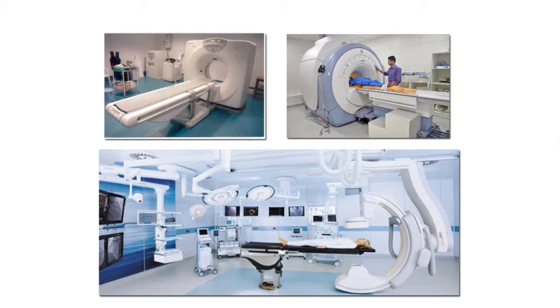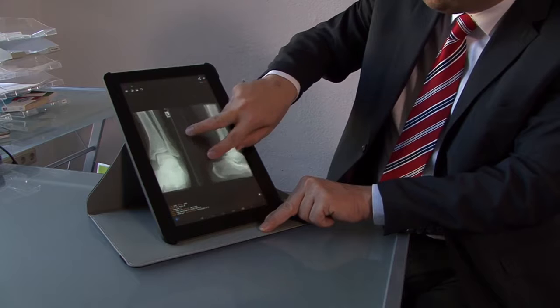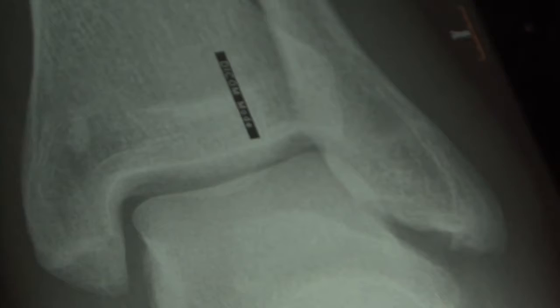Healthcare is one of the most conservative cultures when it comes to adopting new technologies, and in many respects, medical professions lag some distance behind the outside world, especially when it comes to mobile devices. Dr. Arpad Bischoff, a radiologist, noticed the absence of smart technology in his specialty and wondered why.